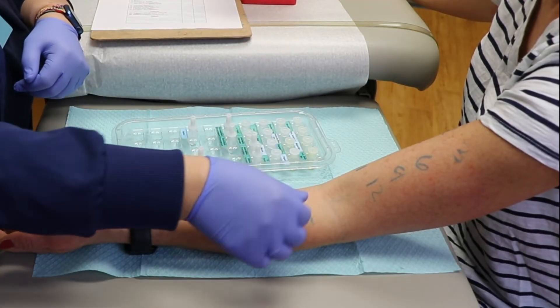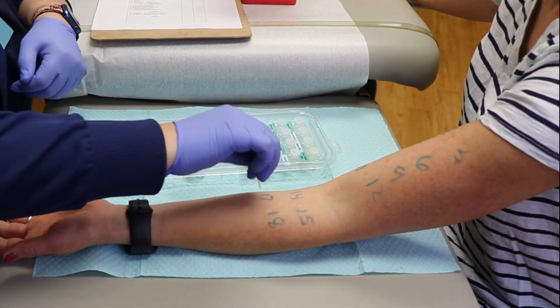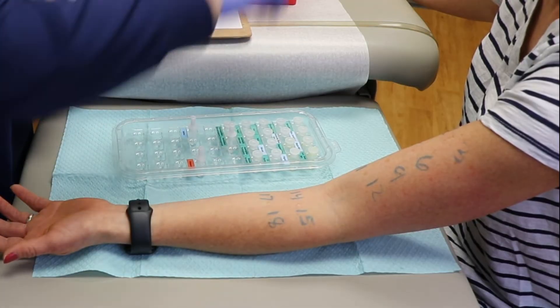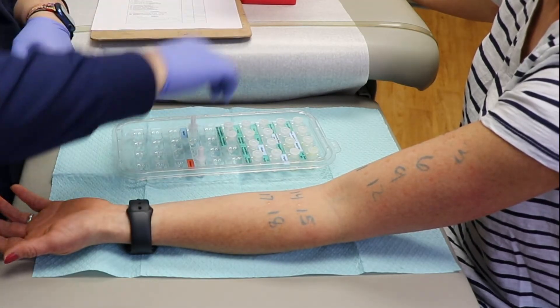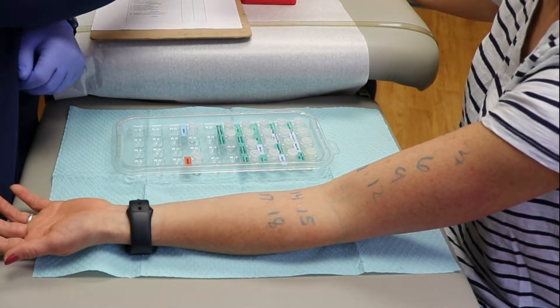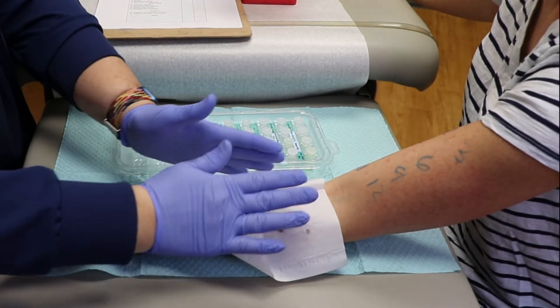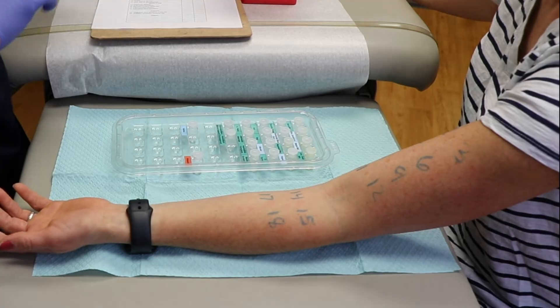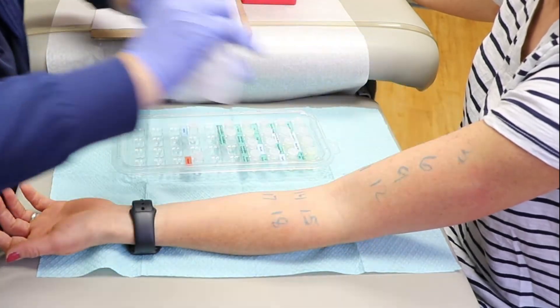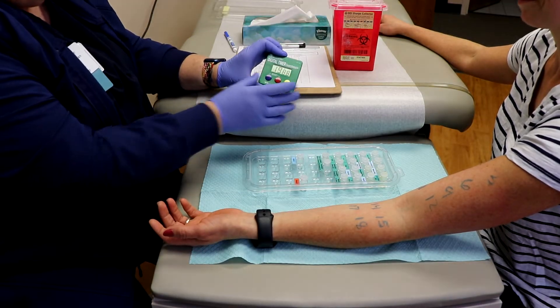A prick is done for each individual allergen. For example, skin testing for environmental allergies may involve 20 pricks for a child and more for an adult. The appropriate number of tests will be determined after meeting with the allergist. If you or your child has an allergy, a little swelling that looks and feels like a mosquito bite will appear at the prick site.